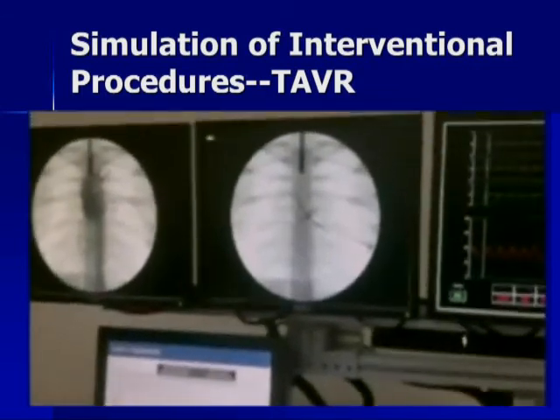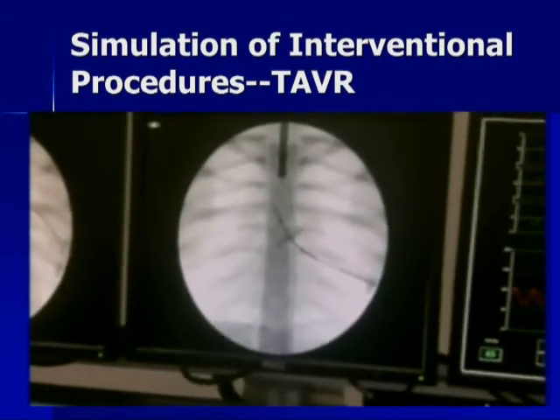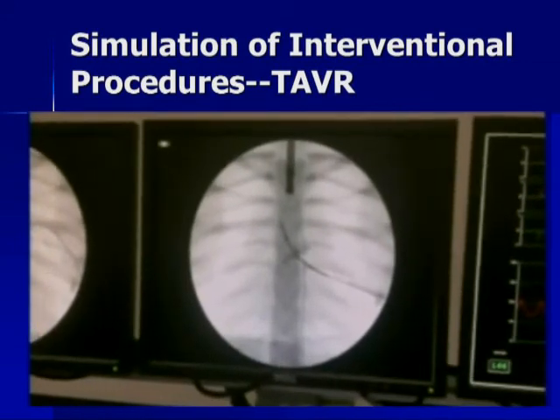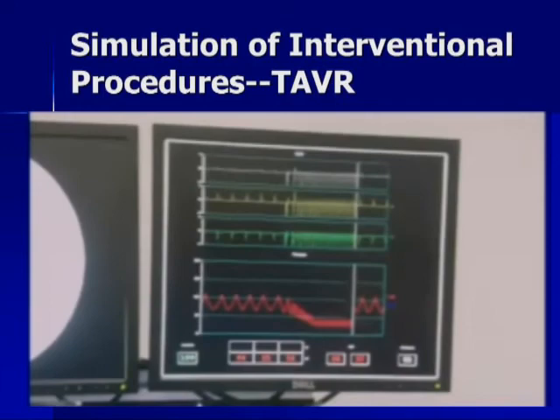Okay, can we hold ventilation? So this is... Turn pacemaker on, please. Pacemaker ready? I'll let you listen to this for just a second here. Okay, we confirm that our pressures drop nicely below 50. Inflate.